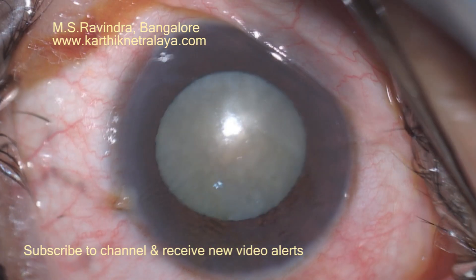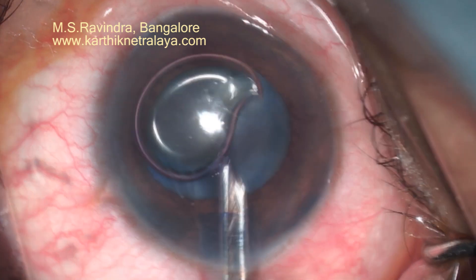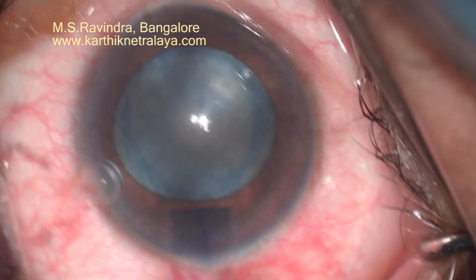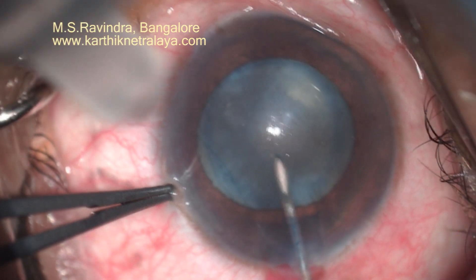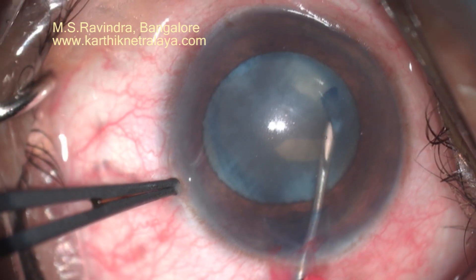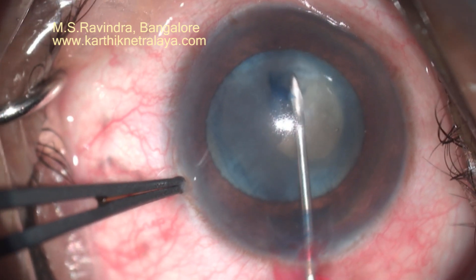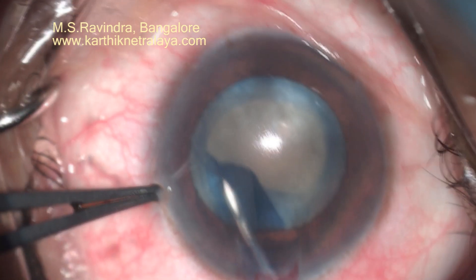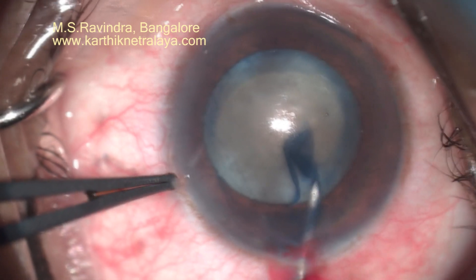For a mature cataract, a translimbal entry is made to the anterior chamber. Air followed by trypan blue is injected; when infused within the air bubble, it stains the capsule instantaneously as the capsule is dry. Aspiration of trypan blue and air from the anterior chamber is done with a Simcoe cannula, then HPMC viscoelastic is infused into the anterior chamber. This fills the tunnel floor entry; the AC remains deep as there is no viscoelastic leaking out of the tunnel, as you have entered the AC by puncturing the floor of the tunnel with the cystitome.